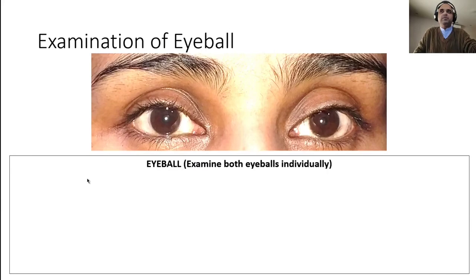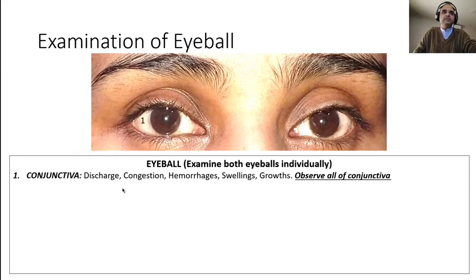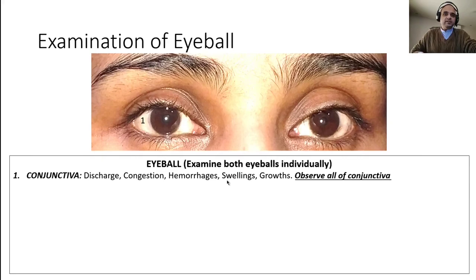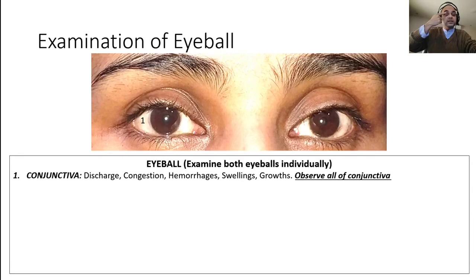Now we come to examination of the eyeball — the structures visible on torch examination. The first and most obvious structure is the conjunctiva. When examining the conjunctiva, look for discharges, congestion, hemorrhages, swellings, and growths. Congestion means dilated vessels in an inflammatory process; hemorrhage is frank collection of blood; the conjunctiva can also have swellings and growths. You need to observe all of the conjunctiva by moving the eyes and sometimes gently pulling the eyelids up and down.